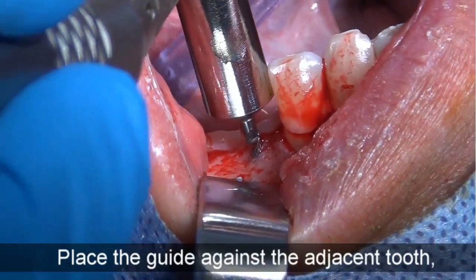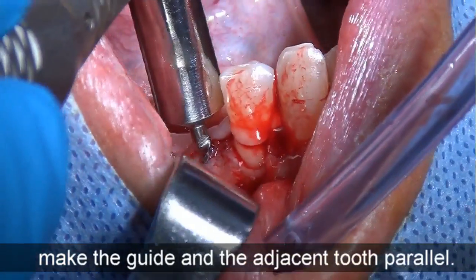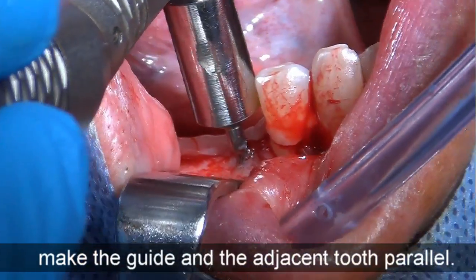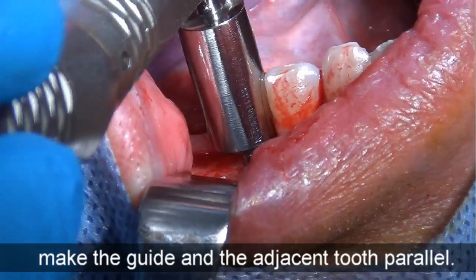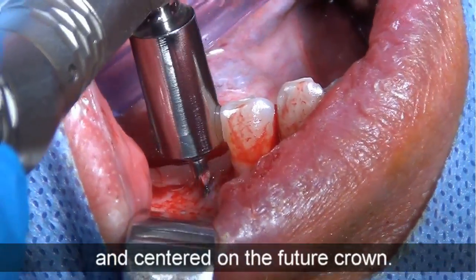Place the guide against the adjacent tooth. Make the guide and the adjacent tooth parallel. The drill is automatically aligned and centered on the future crown.